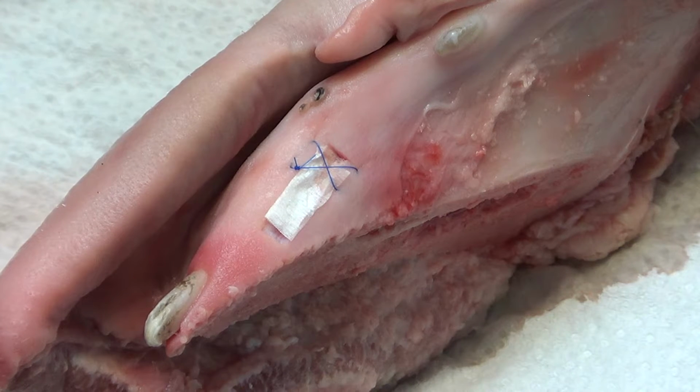Okay, so now we have to work in the vestibular part of the tooth. So we have to work between the cheek of the pig and the teeth, like in this region. Okay, everyone understand what this region is in their mandible? I can show you.